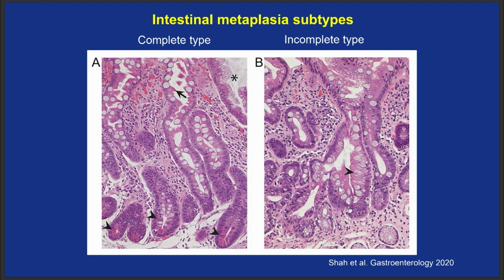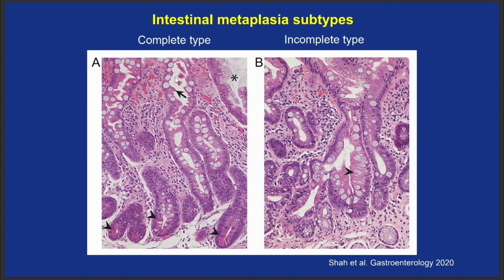So I wanted to mention that because this is one of the important characteristics. Usually this is very well organized, and the nuclei are very aligned. But when you see this other type, sometimes it reminds you of dysplastic changes. Another thing that I wanted to mention in this part is that these big goblet cells and the brush border should be expected only in the upper half or two thirds of the mucosa, because if you look at the base of the glands, of course, you won't find those characteristics.